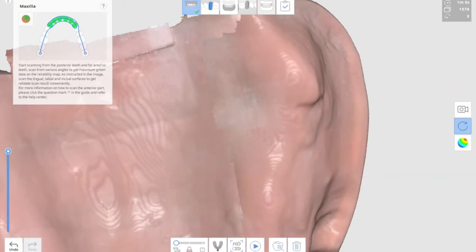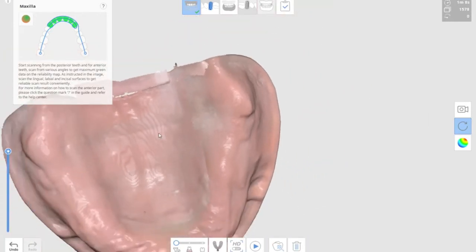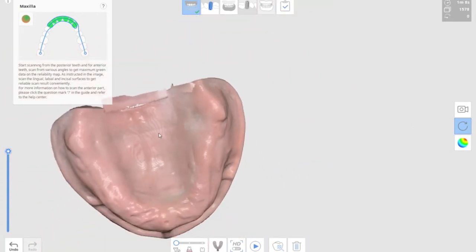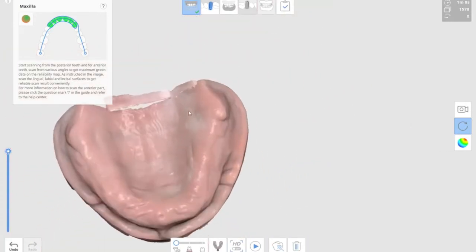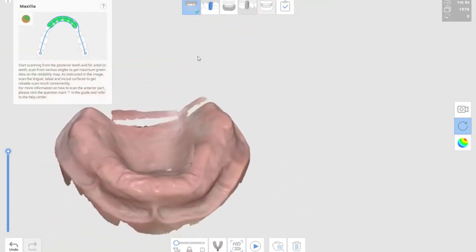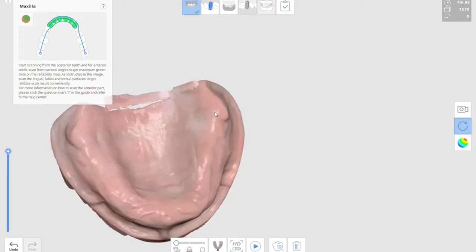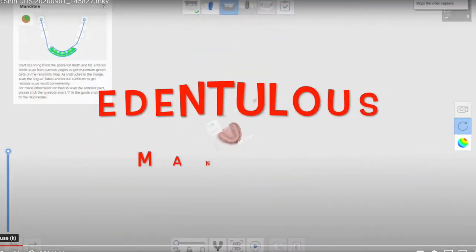In this particular case, we scanned it in the model. The next one is scanning edentulous mandibular model.